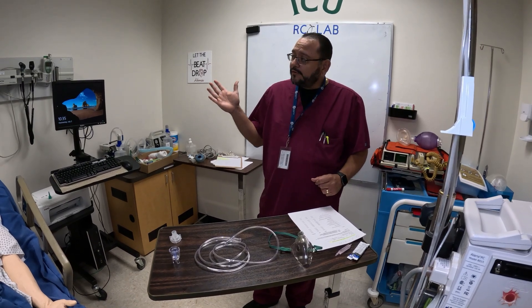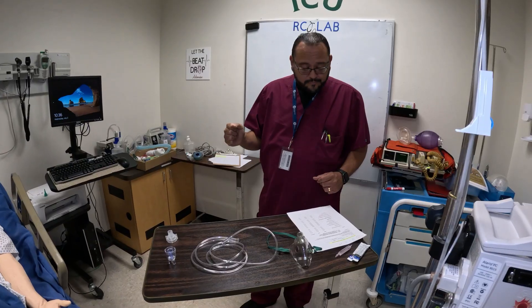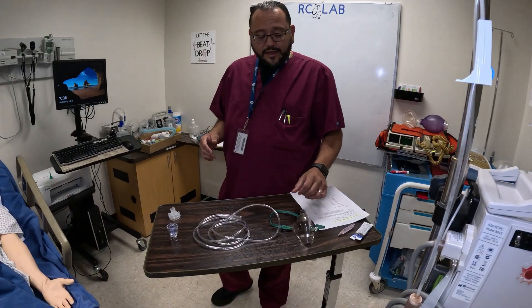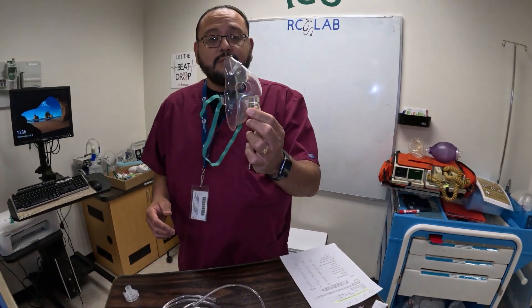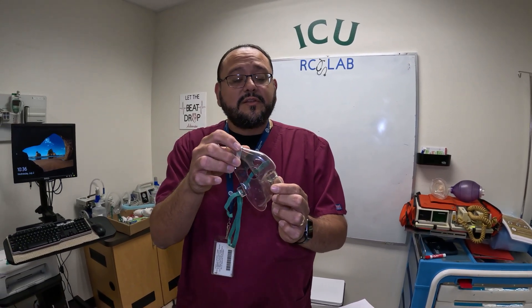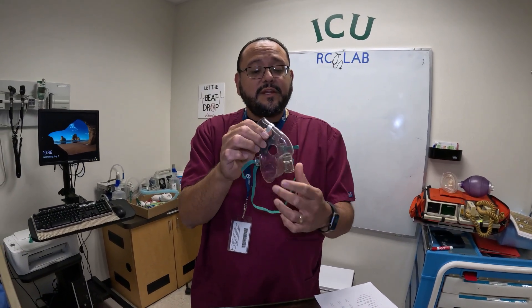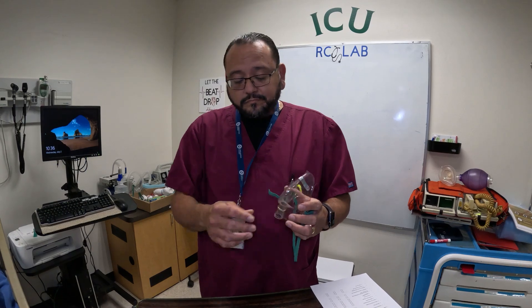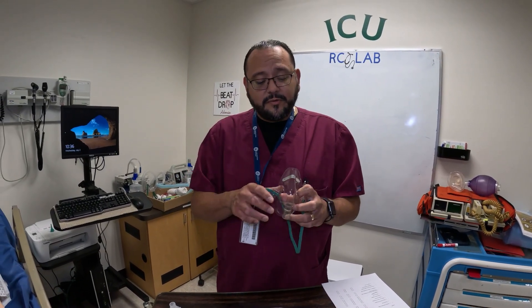We're going to make sure we have a flow meter — an oxygen flow meter and an air flow meter. We have our small volume nebulizer set up. This is just a typical, normal aerosol mask. You have two holes, and a bridge where you can make this fit the patient more comfortably just by opening, closing, and fitting. You have your strap, you can make adjustments to that, and this is the part where the nebulizer cup fits into. You can also give a mouthpiece treatment if the patient prefers that, which I do recommend mouthpiece over mask, but for demonstration purposes we're going to just talk about the mask breathing treatment.